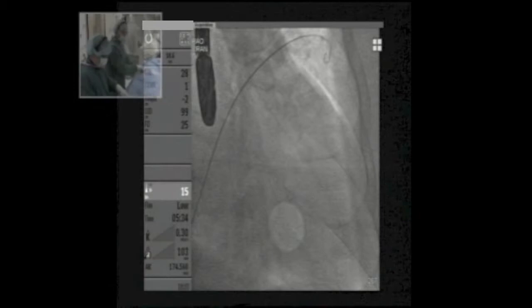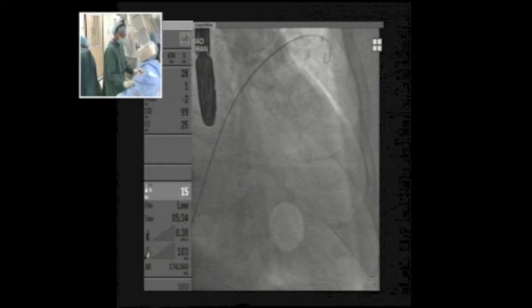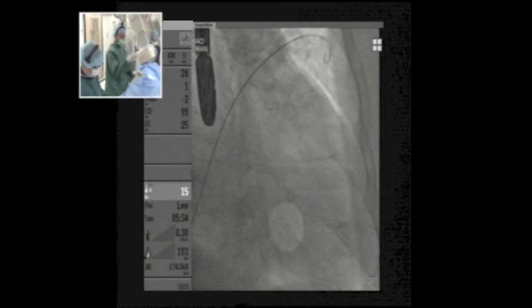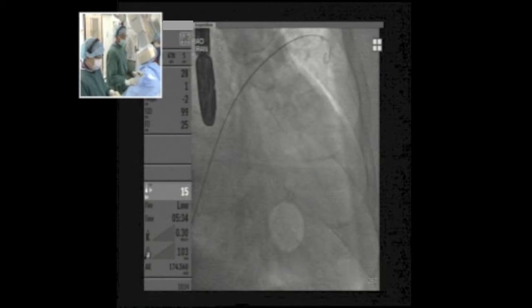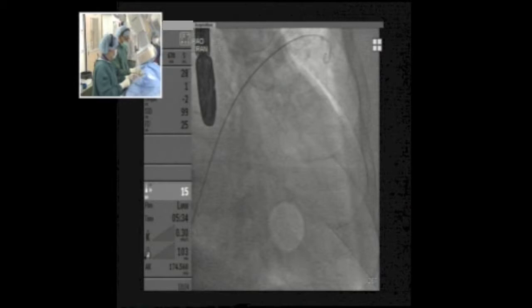A question from Gabriel: do I ever use a single-curve delivery sheath system? I use the 45-45 degree double-curve sheath in 95% of procedures. Very rarely I use only the single 45-degree sheath — typically when the appendage angle is more straightforward. I feel it's important to have two curves to go more anterior into the appendage.